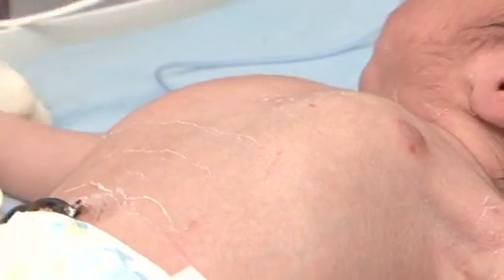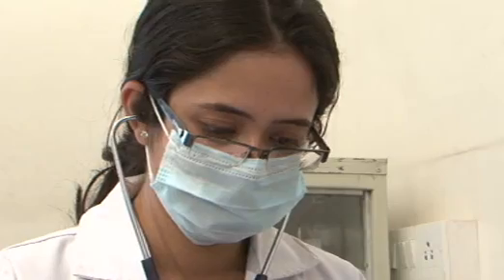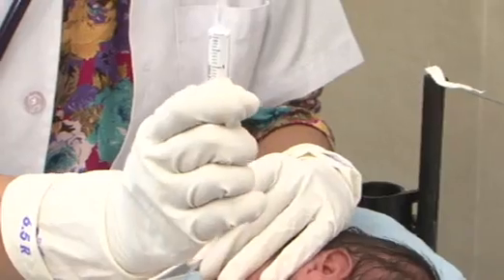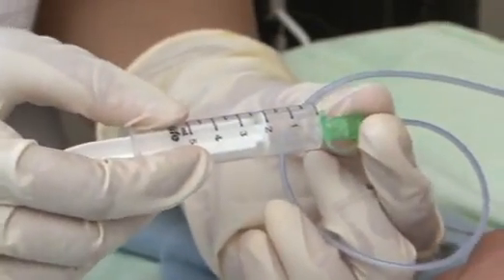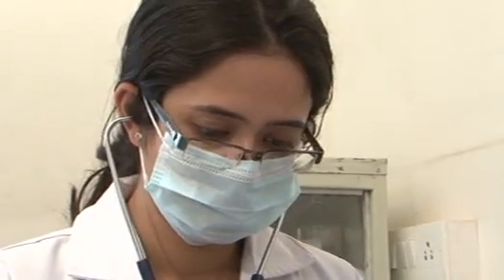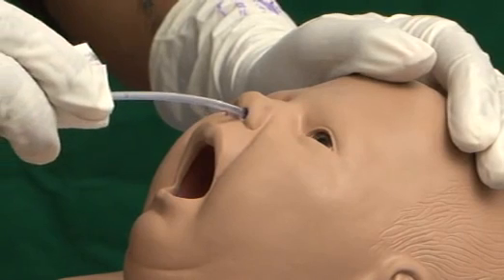Check correct insertion of the tube by placing a paediatric stethoscope just below the xiphoid sternum slightly on the left side of the upper abdomen. Attach a syringe and push 2 to 3 cc of air to auscultate for the sound of a gush of air. If no sound is heard, withdraw the tube immediately and try re-insertion or call the doctor.